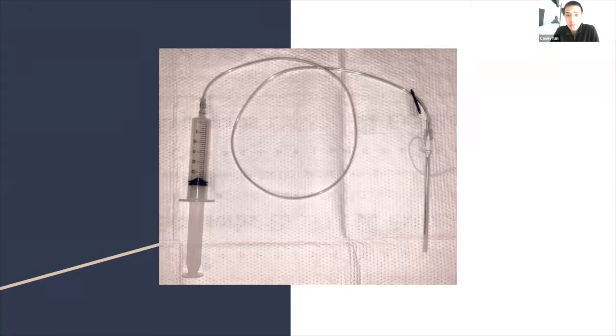What you have here is the normal setup. So you have, well, this is actually sort of a fancy spinal needle. It has what you can see is like a pressure transducer coming off the side, which can help you figure out when you've popped through a certain space. In our case, in the emergency department, we'll probably only have access to a spinal needle. But in any case, you can still attach the tubing to the back end of it and have that going into the syringe. The other pointer here is to please make sure that you've primed your tubing. Please don't put like 3 to 5 cc's of air into your patient's thigh. That would be bad.